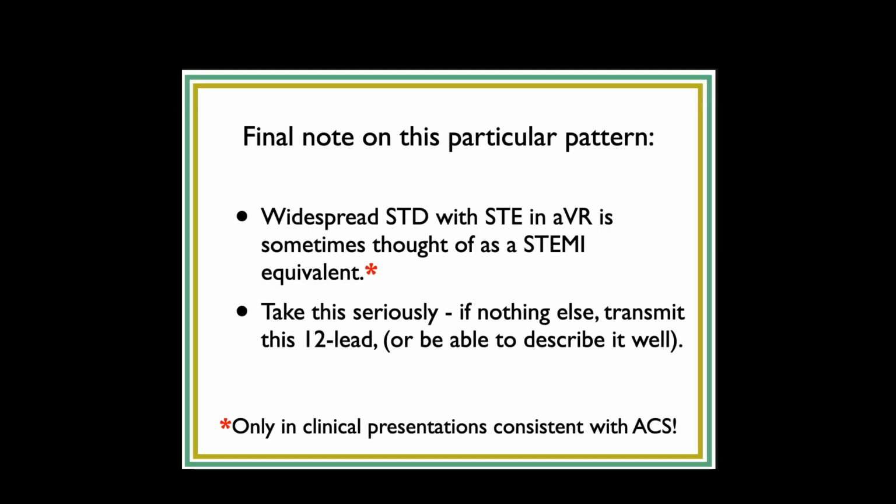So, final note on this particular pattern. Again, widespread ST depression with ST elevation in AVR is sometimes thought of as a STEMI equivalent. So what do I mean by that? As far as I can tell, the American cardiologists have not made it formal that this is a STEMI equivalent, meaning that if it was written in, you would call a STEMI alert.